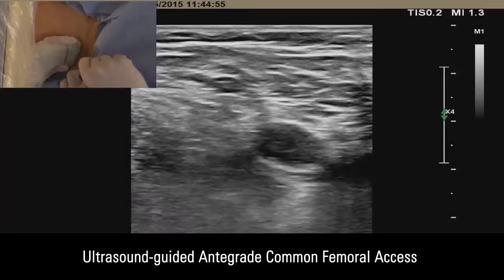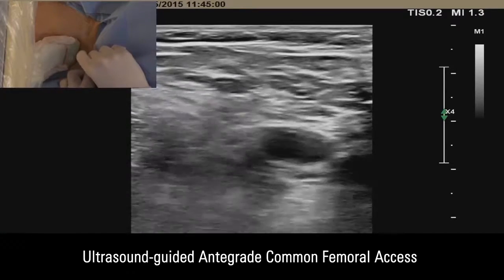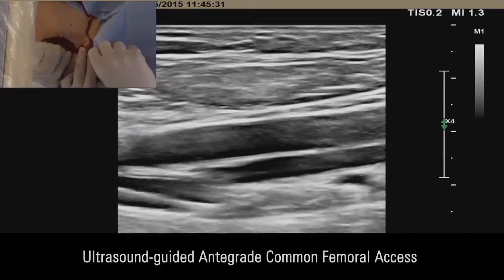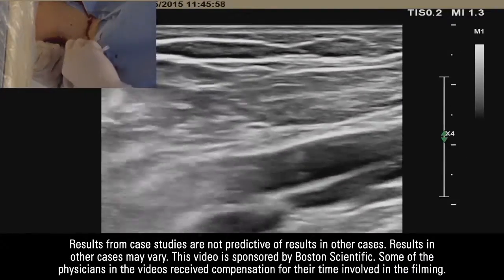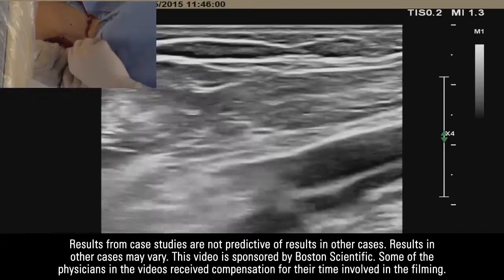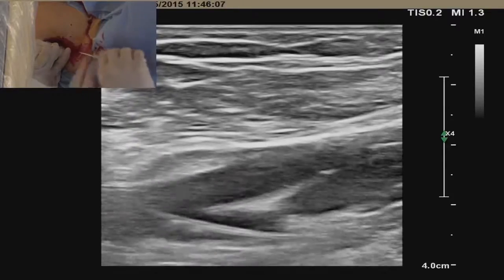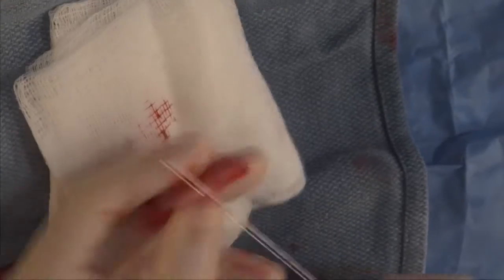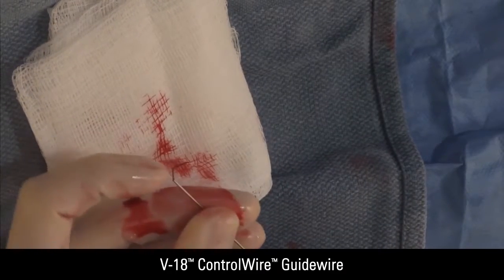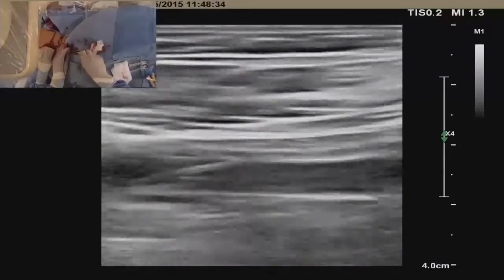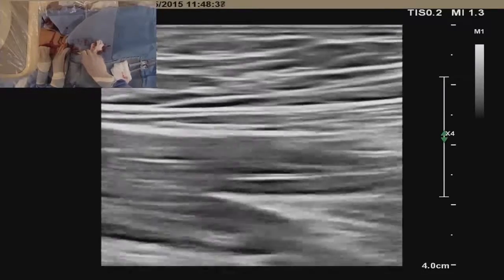For these types of cases, we usually start with antegrade access. What you see here is the access wire being subselective into the deep femoral artery, which is not unusual for a lot of our antegrade access cases. To bypass this problem, we proceed with using a 0.018 wire — in this case, the V18 wire. We have a double bend on it, each one at 45 degrees, and under ultrasound guidance we will redirect it into the superficial femoral artery.